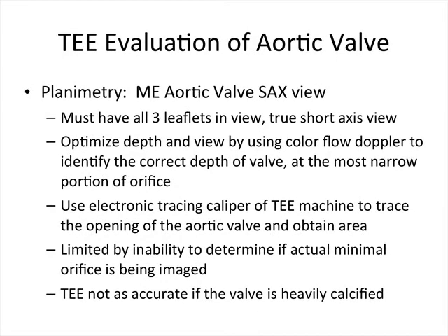Two-dimensional echocardiography in the mid-esophageal aortic valve short-axis view at approximately 45 degree multiplane angle allows the aortic valve orifice to be seen and measured or traced. This is called planimetry. For planimetry to be accurate, it is important to identify the actual minimal orifice. It is easy to be either superior or inferior to the actual cross-section of the aortic valve. All three leaflets of the aortic valve must be seen.